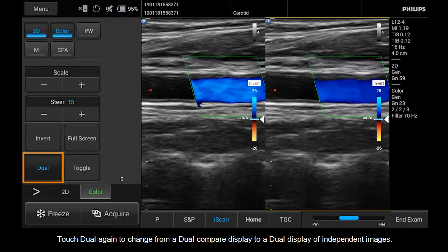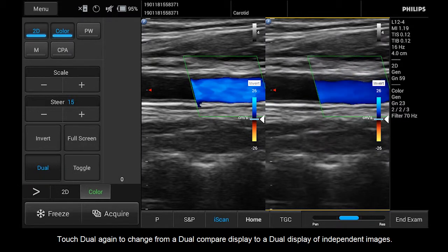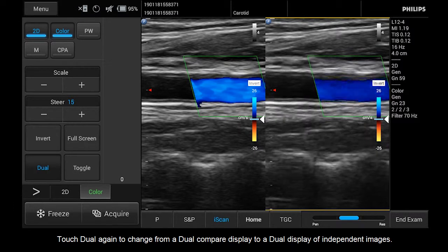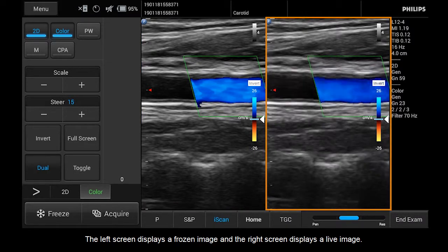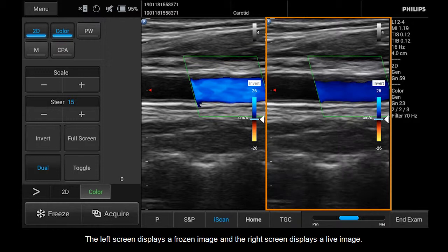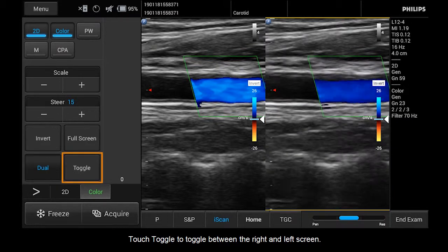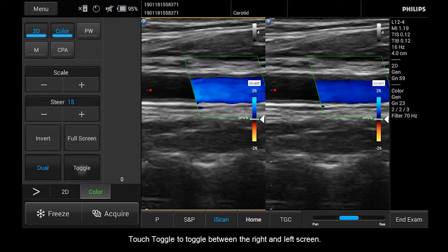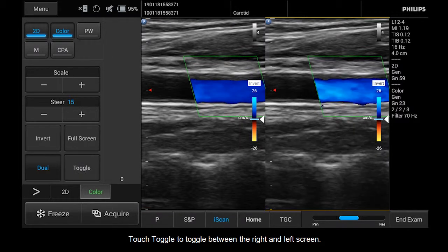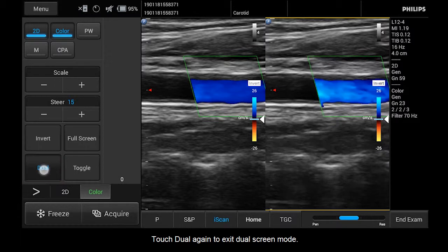Touch Dual again to change from a dual compare display to a dual display of independent images. The left screen displays a frozen image and the right screen displays a live image. Both screens will show a color image. Touch Toggle to toggle between the right and left screen. Touch Dual again to exit dual screen mode.